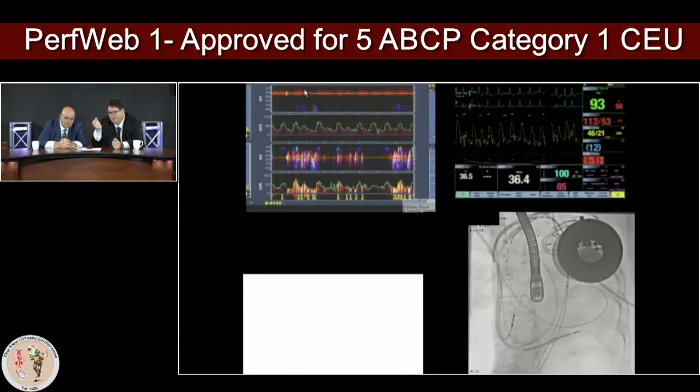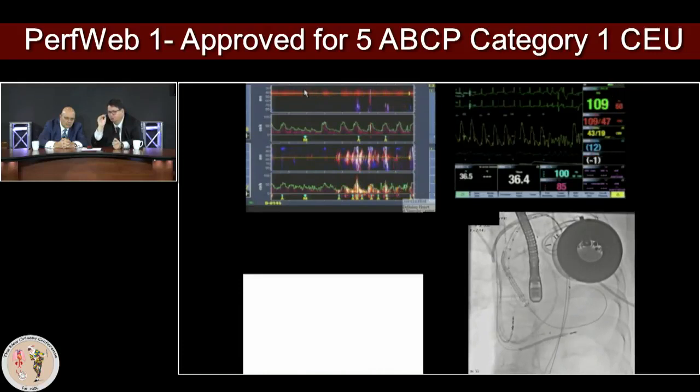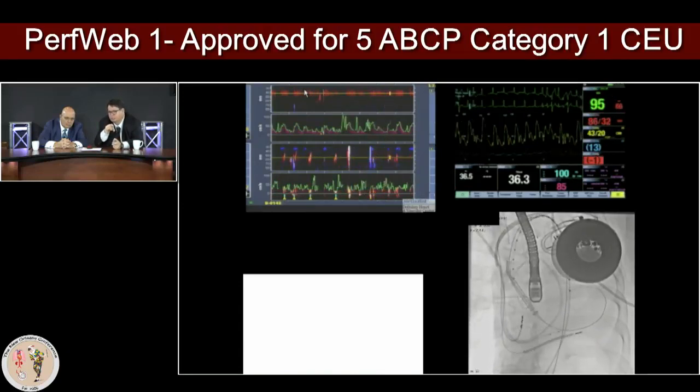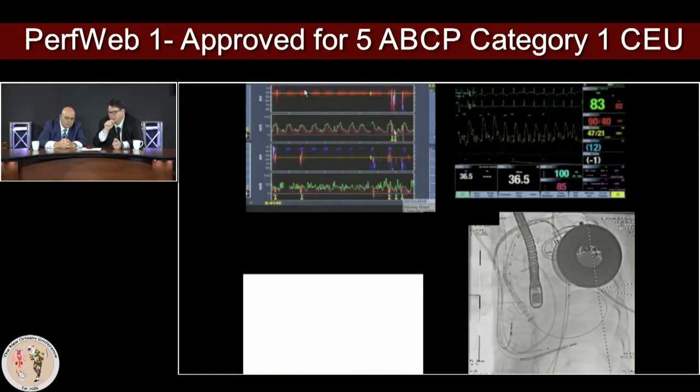So while we are passing in the arch, we're not even close to the valve, but we had major unilateral embolization. And after this unilateral embolization, I am losing signal. I lost my left MCA signal, and a few debris went to that left MCA, but you can compare to the upper screen on the right side, you still have a flow. This is a stroke happening in front of your eyes, and I do not need to wake up this patient.